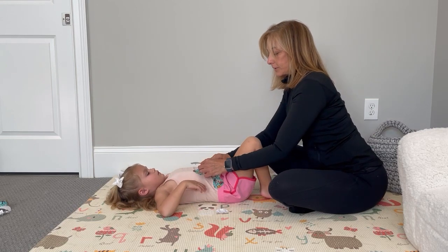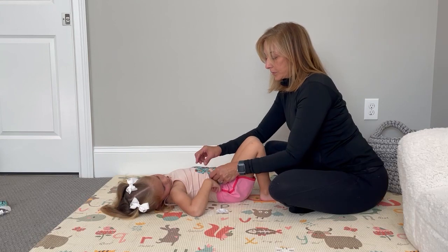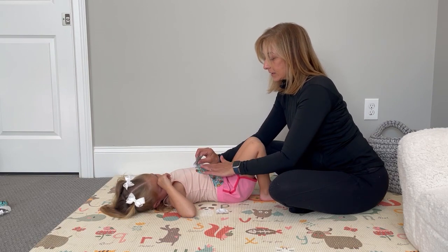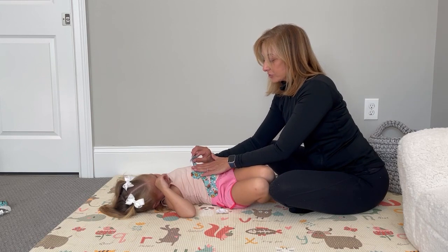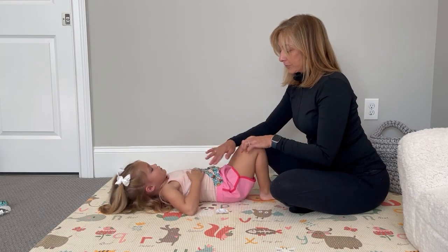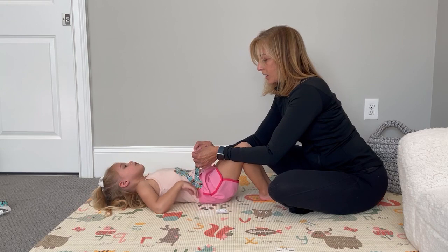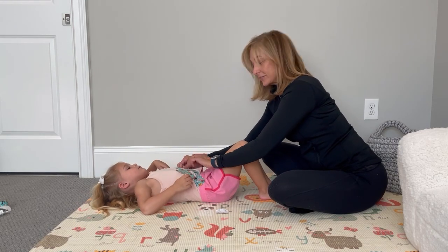This is for providing space for the belly button, or if they have a G-tube. You would put one across the top — remember the same concept of stopping at the belly button. Turn the knees toward the anchored side and then stretch a little bit across. Now I'm going to bring this one across over here. See how I made space for the belly button?